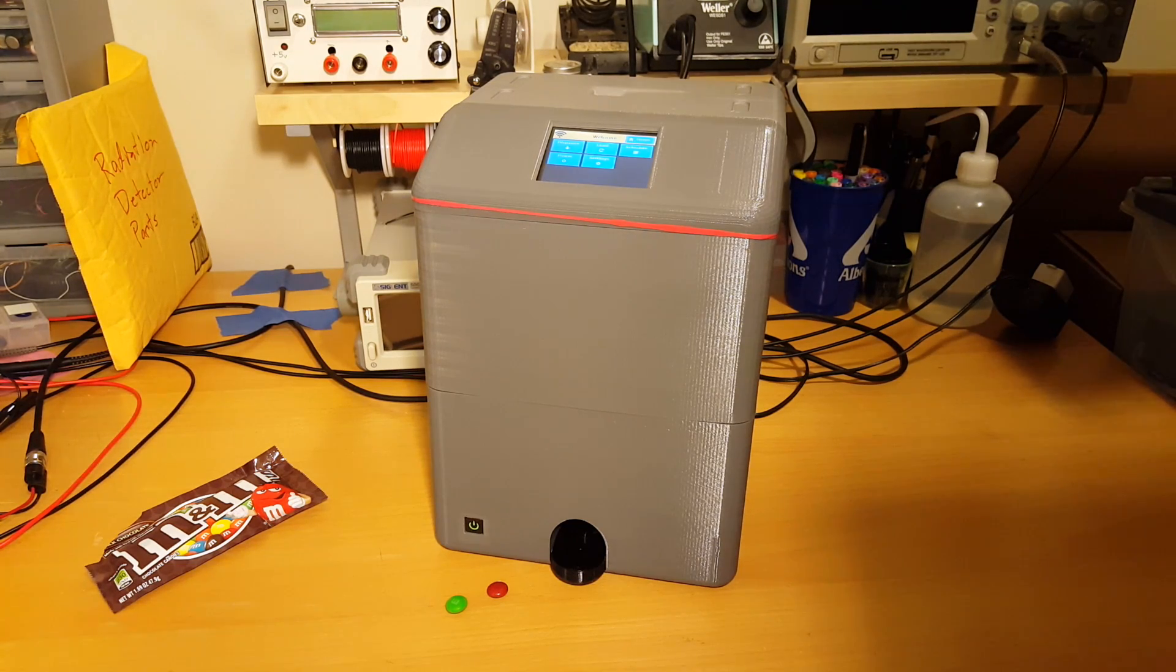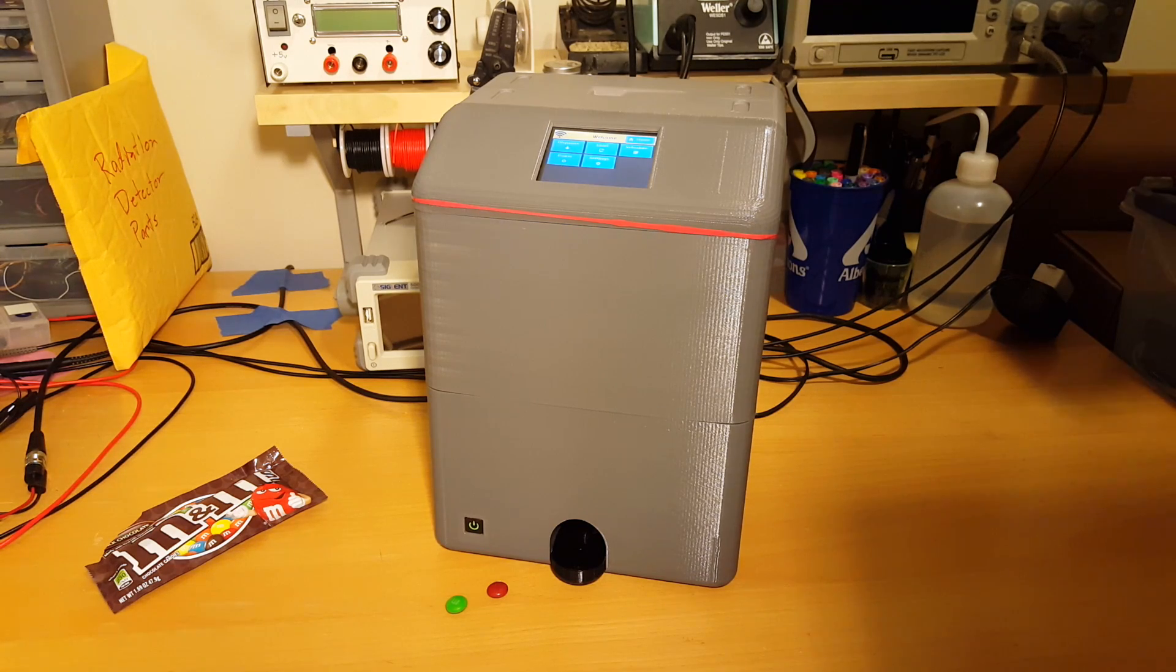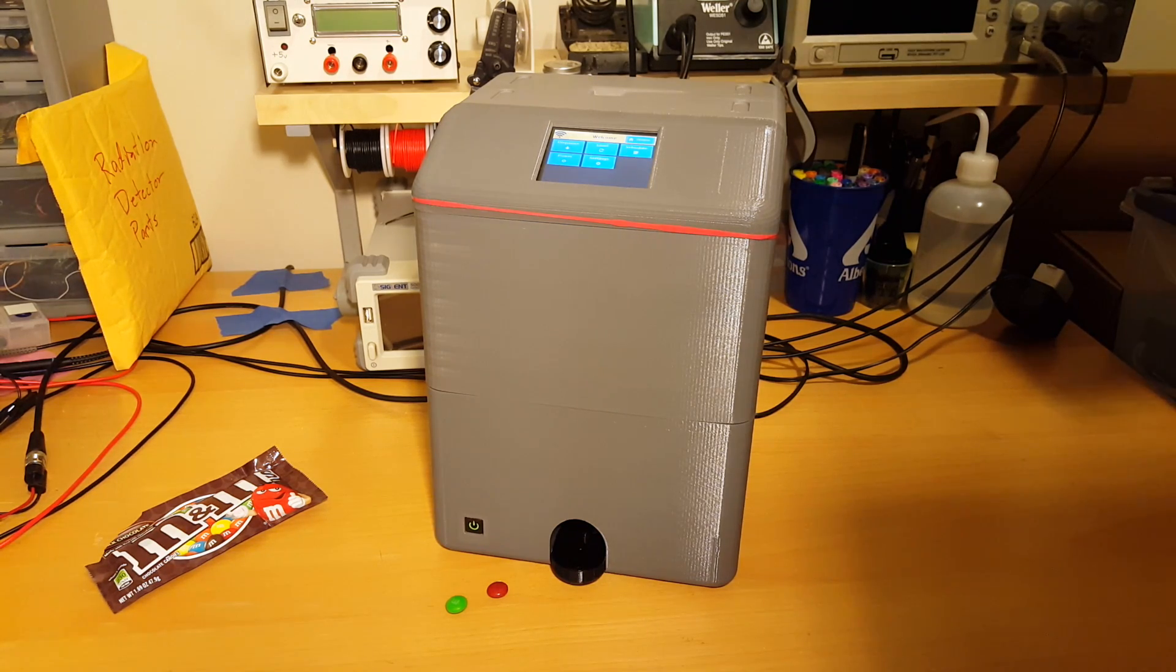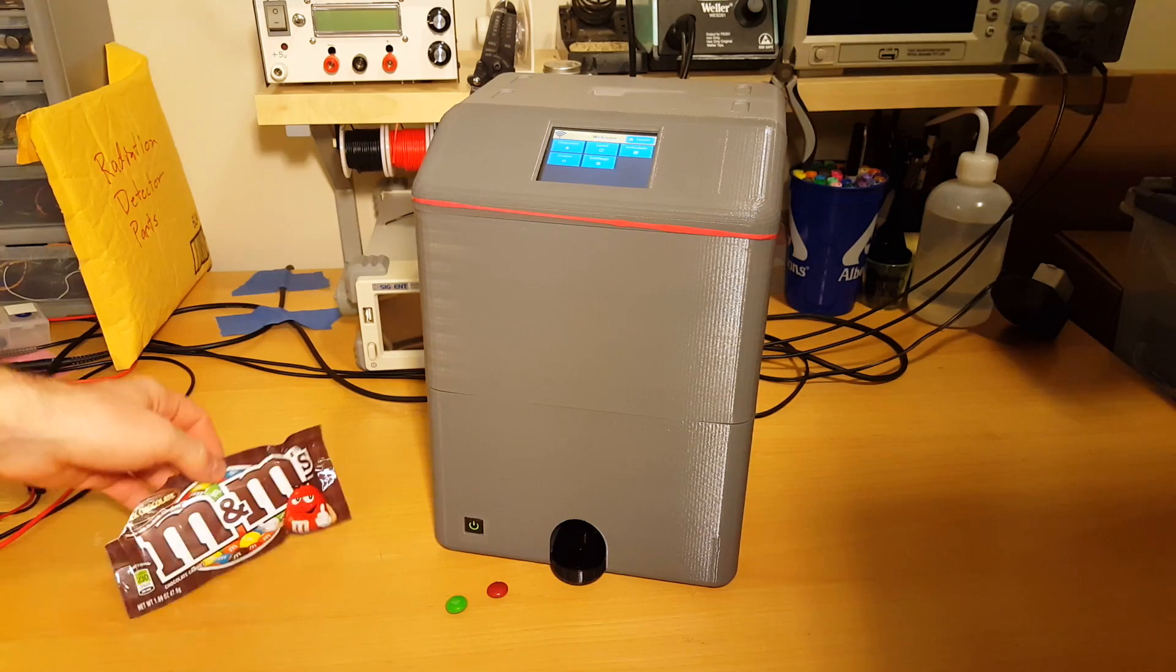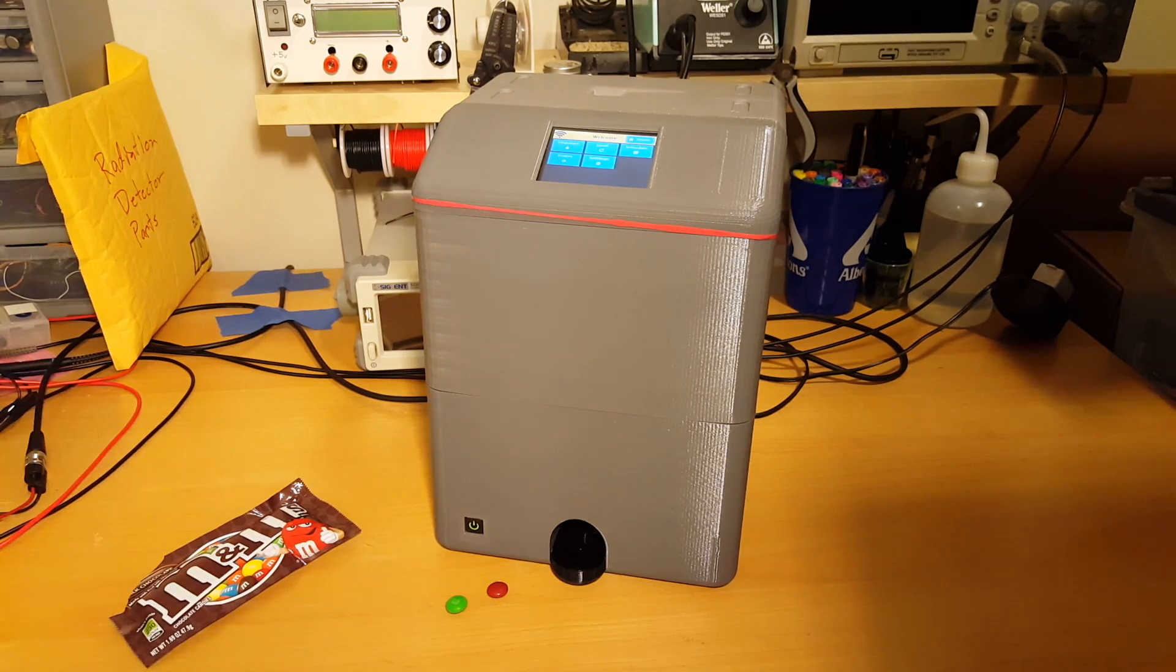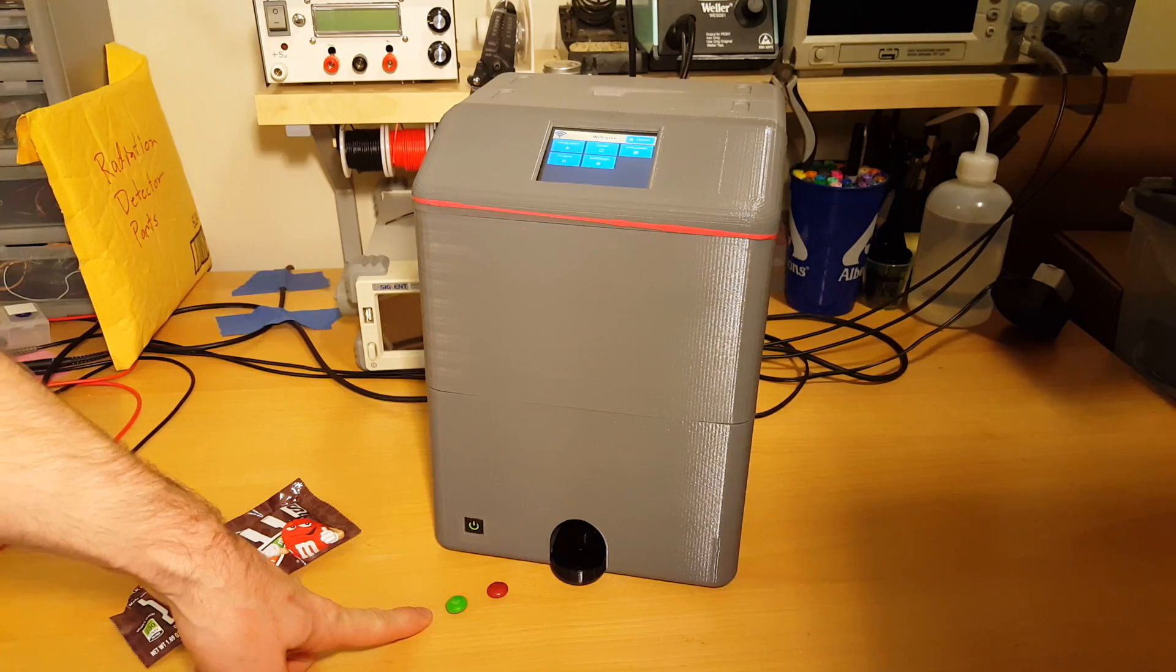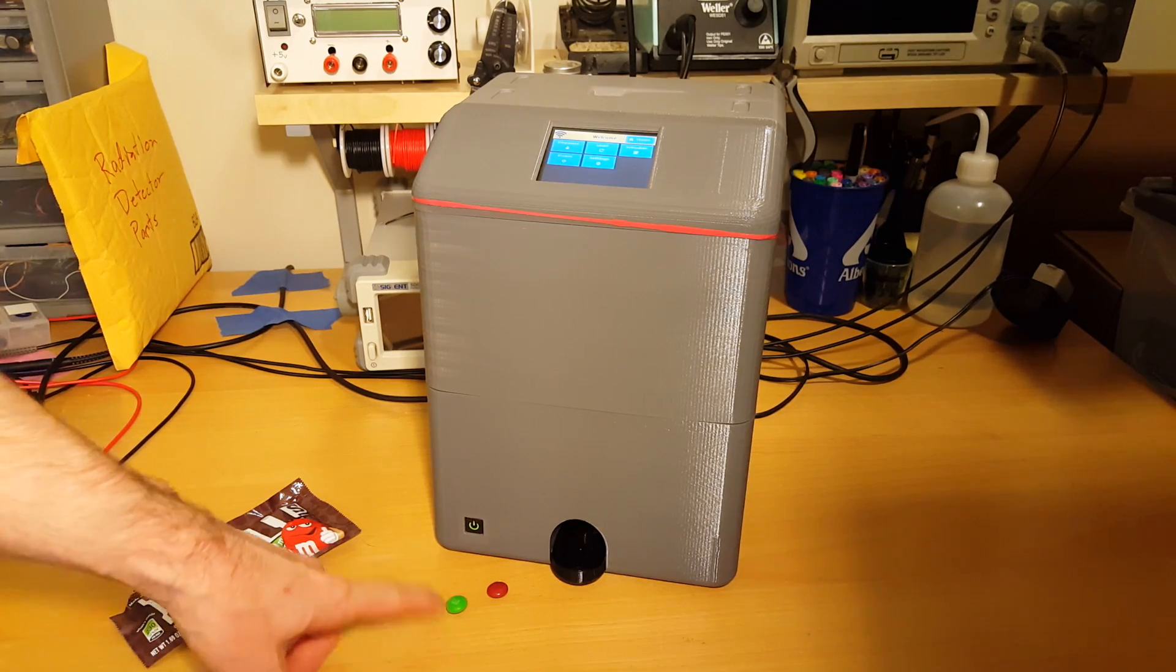Hi everyone, welcome back to my second video about the smart desktop medicine organizer. Today I'm going to do what I call the M&M test, which is essentially using M&Ms to simulate pills.